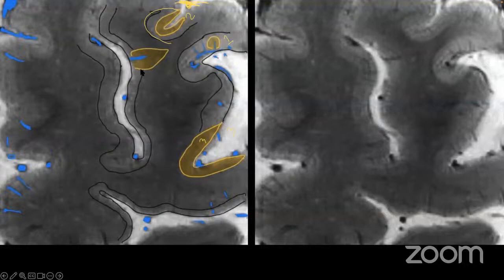And the easiest to pick is a type that is again around a central vein, but extends to the white matter as well, which is more frequent and easier to pick. And this is actually not a completely intrinsic cortical lesion. It is more of a cortical juxtacortical lesion. So this is the whole story. This is the whole thing you need to know about the types of cortical lesions in people with MS.